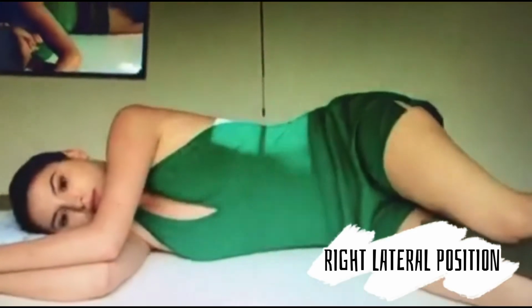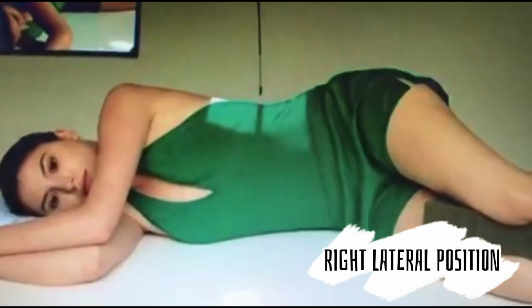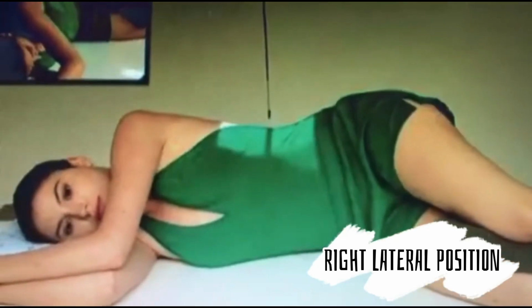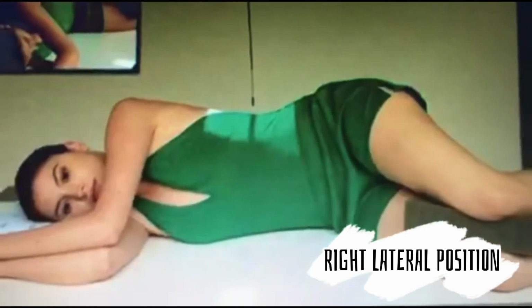Lastly is the asthenic patient. Imagine that this patient is asthenic; we center the ray about 2 inches below the L1. Again, this is where the L1 is. We measure at least 2 inches, and that is where we point the central ray for asthenic patients.